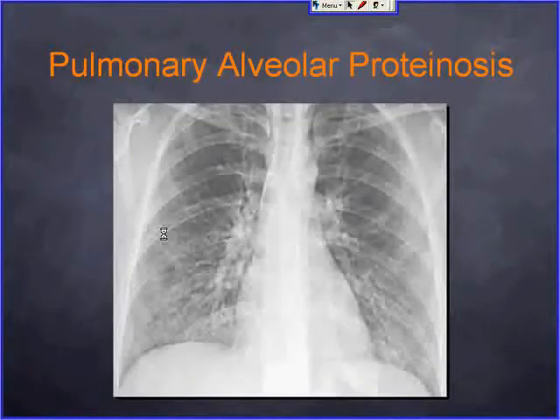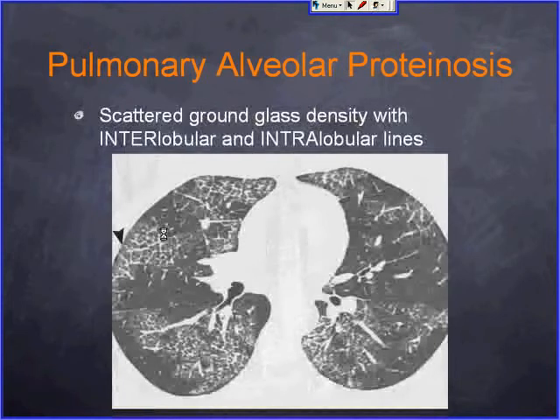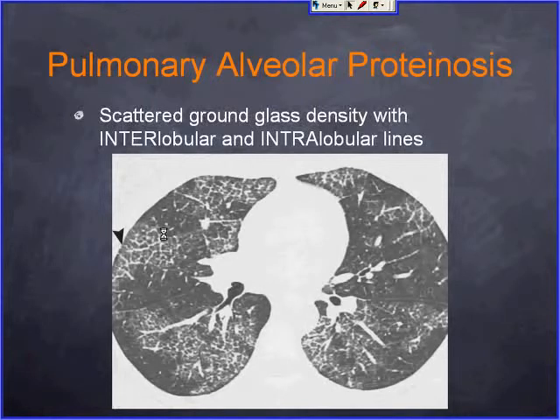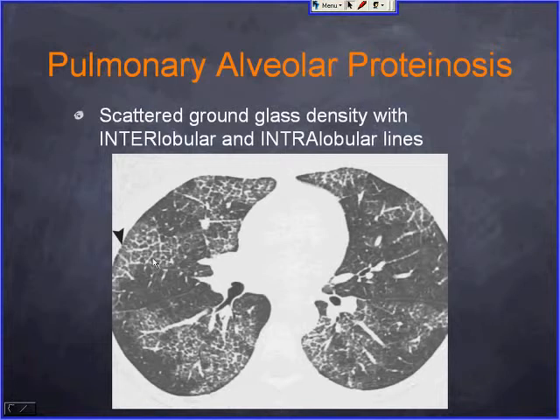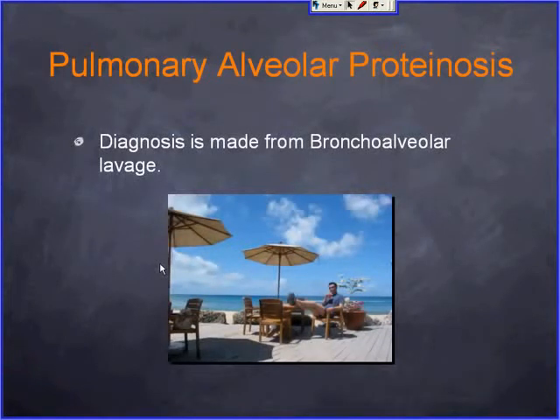On high-resolution CT, there is scattered ground glass opacity, which in this example is slightly less prominent compared to the interlobular and intralobular septal lines. You can appreciate all the interlobular septal thickenings with underlying intralobular lines within the secondary pulmonary lobules. It is a diagnosis impossible to make radiologically, so you can let the respirologist do the BAL and make the diagnosis.